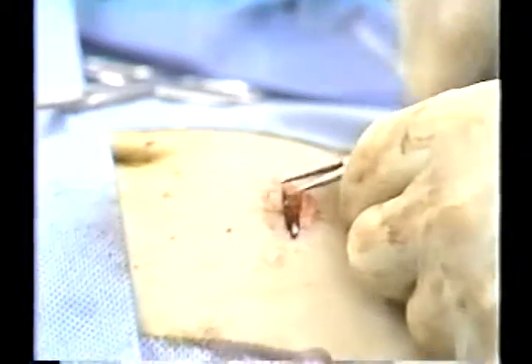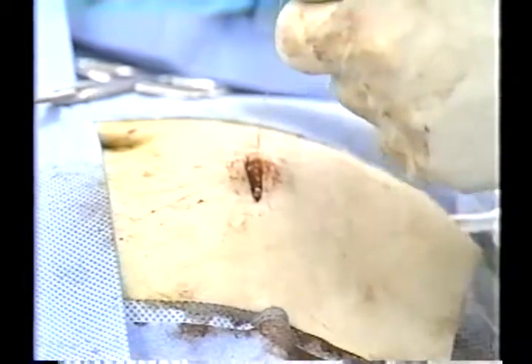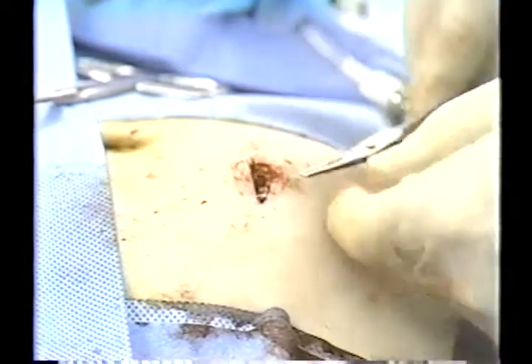The line is then connected to a bag of dialysis fluid and is infused into the abdomen. The subcutaneous and primary skin incision is then closed. There is no need for suture material at the exit site.